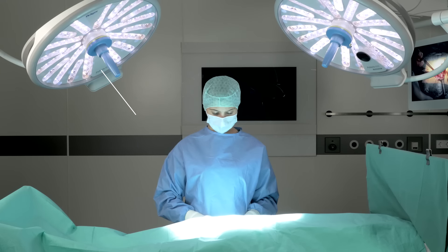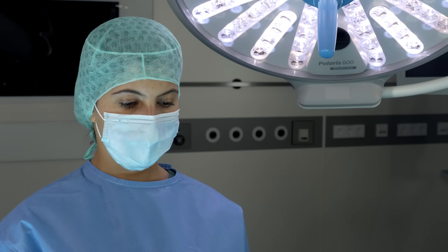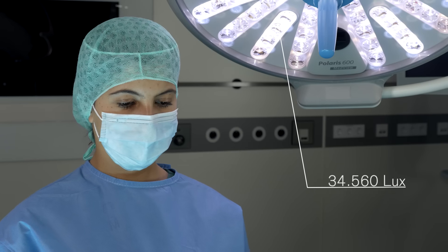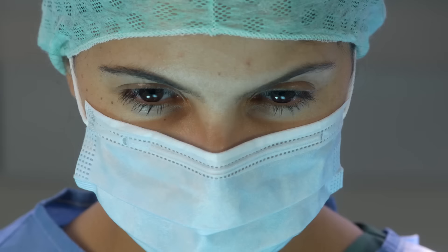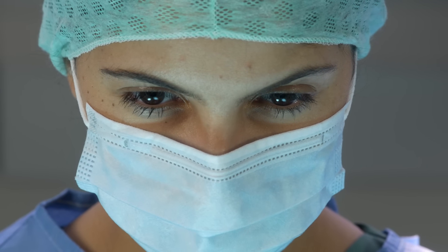The ideal working distance is between 90 centimeters and 120 centimeters. The Polaris 600 emits a light intensity of 20,000 to a maximum of 160,000 lux, which can prevent eye fatigue and supports a long period of concentrated surgery.